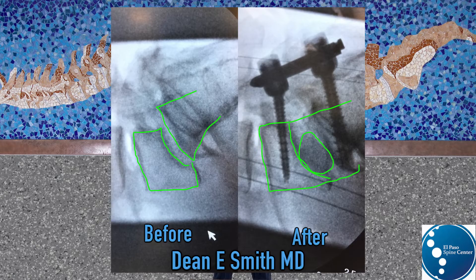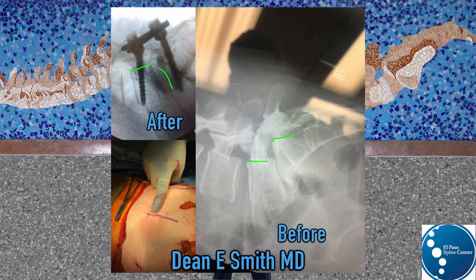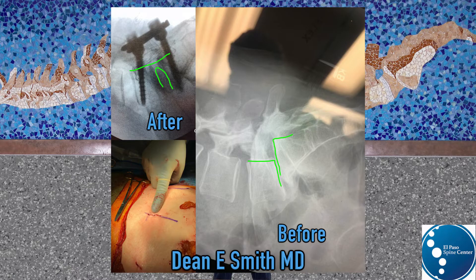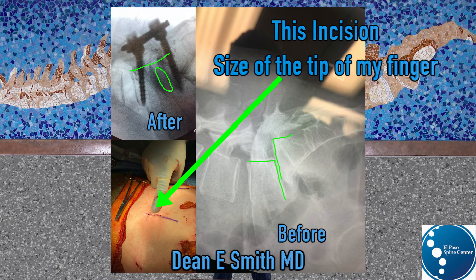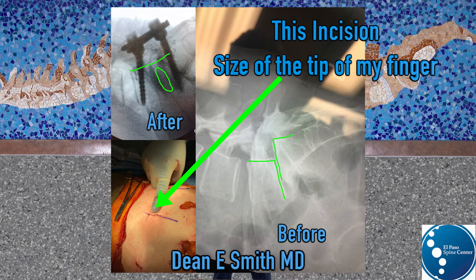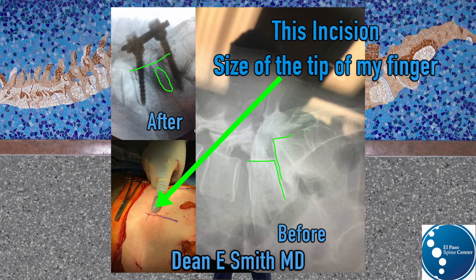Many times we will place some screws through a minimally invasive second incision to make sure that we can get adequate alignment. You can see the incisions are about the size of the tip of my finger.